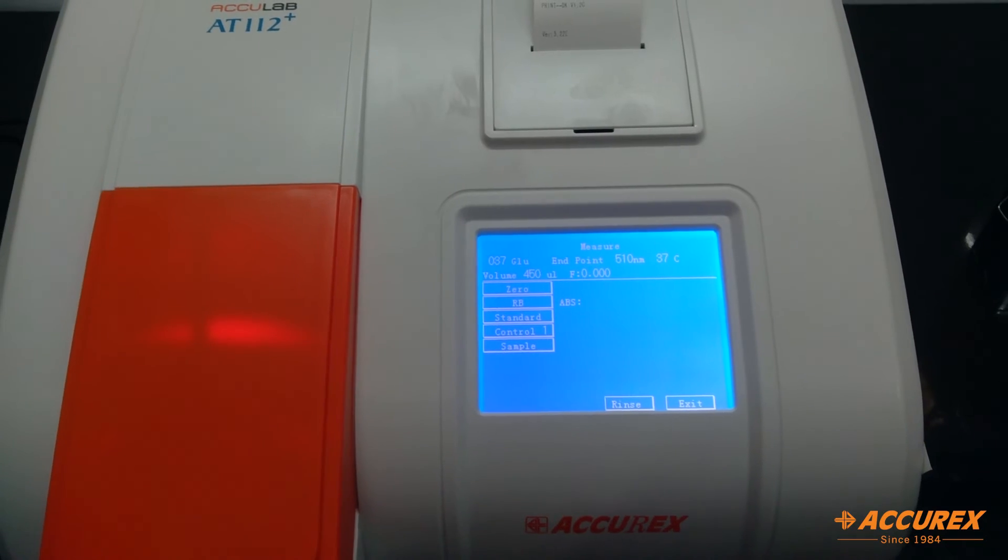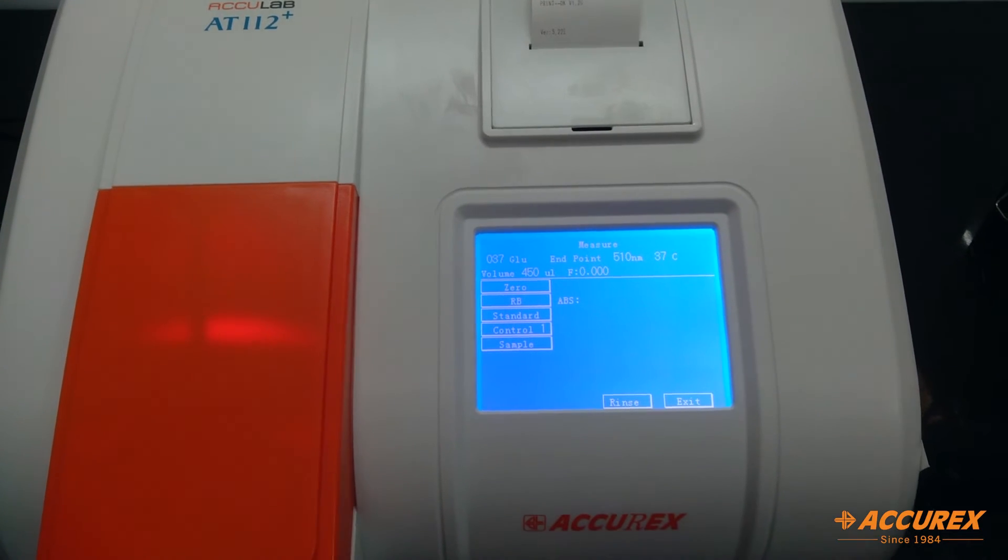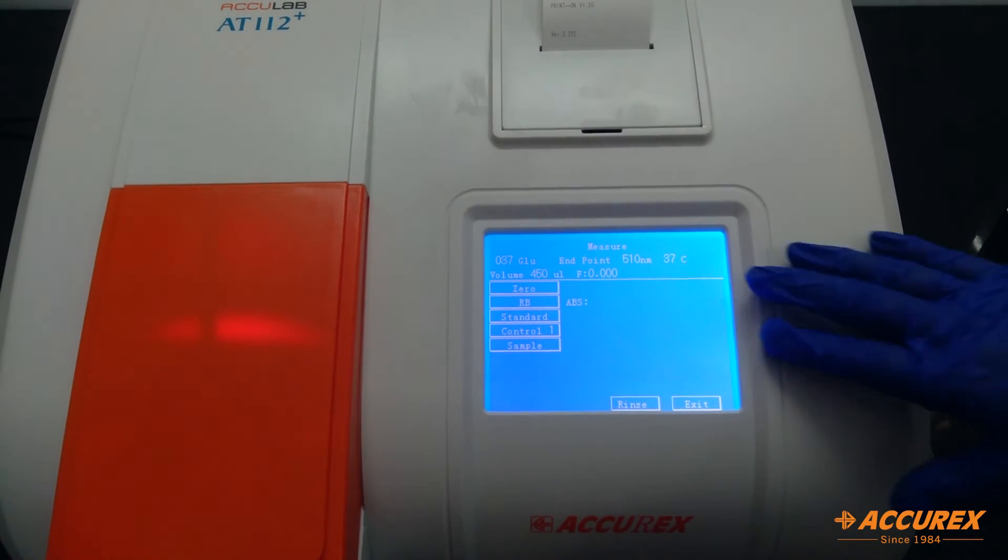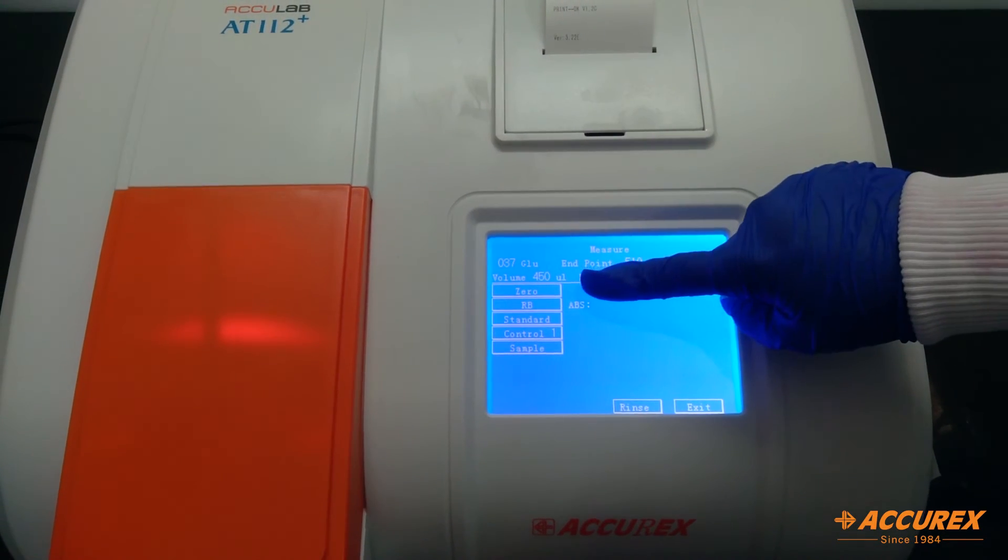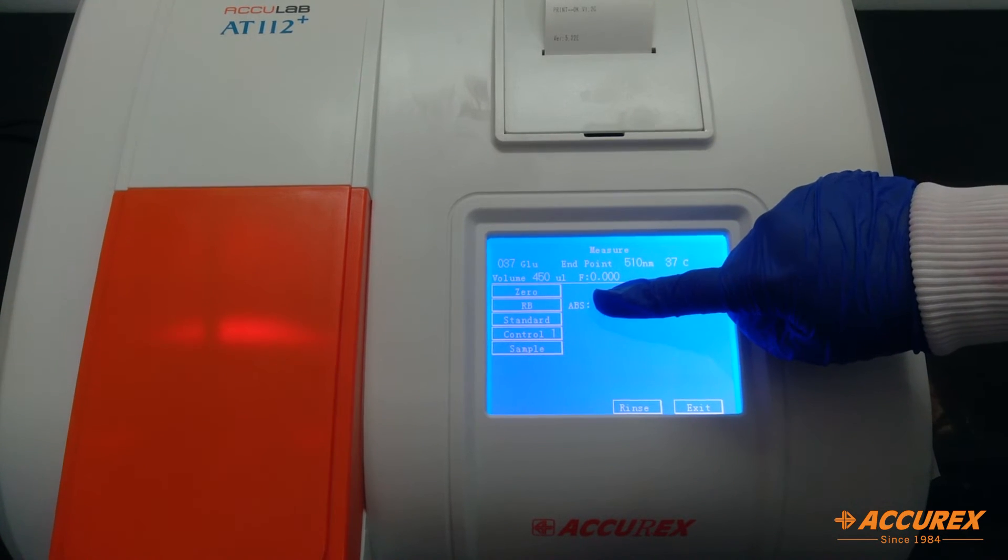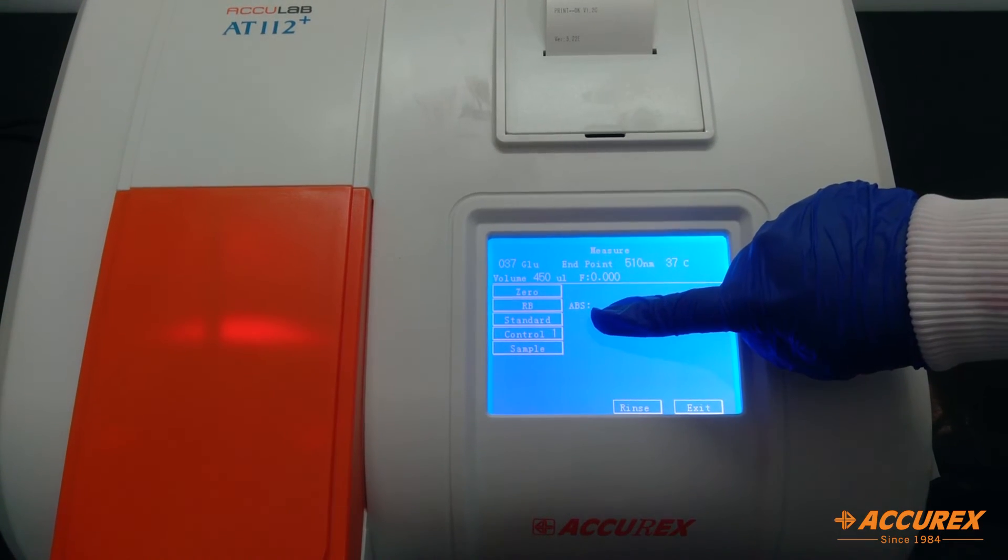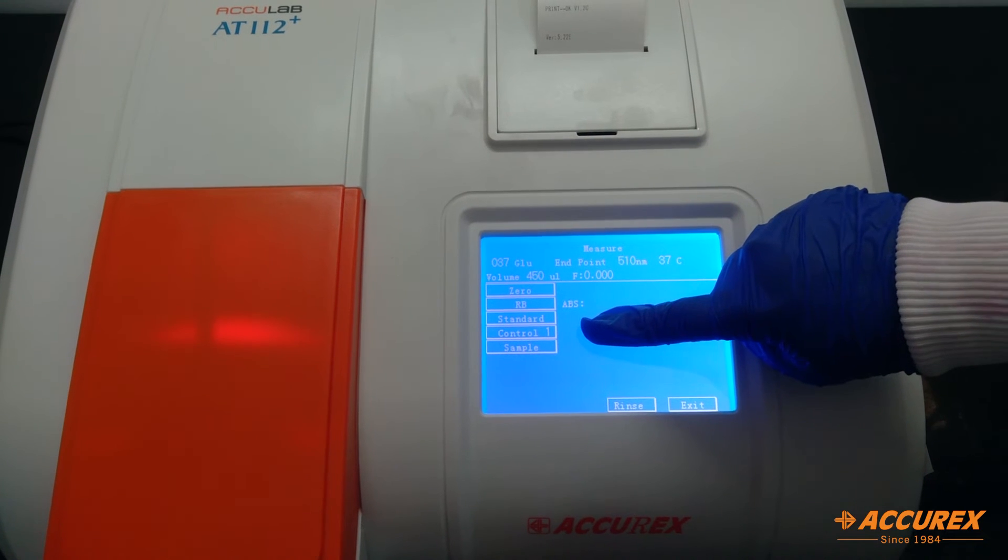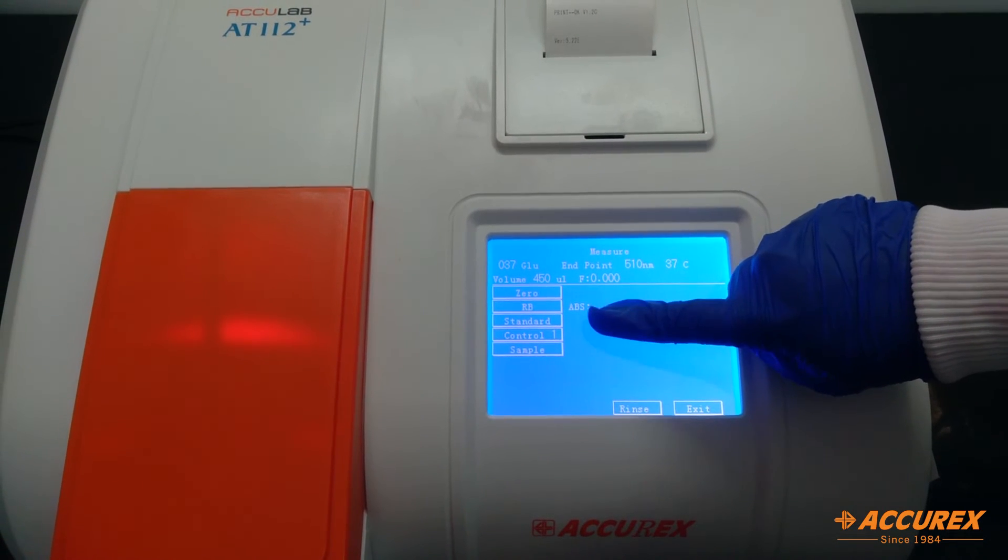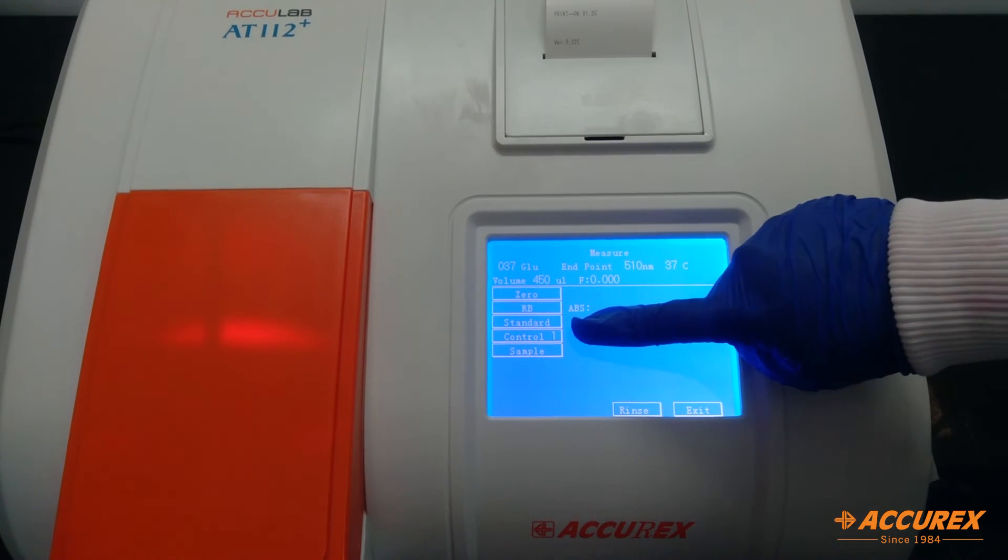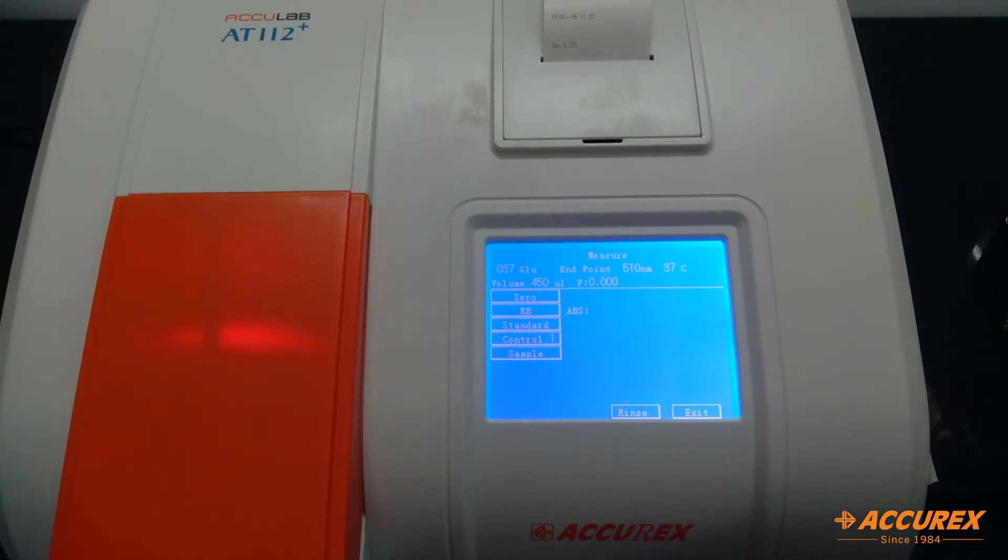We have created a new test, now we will go for the calibration part. So here you can see the first one which is zero, second is reagent blank, third is standard, fourth is control, and last one is sample. So if you want to run control you can click over here, otherwise you need to click on sample.